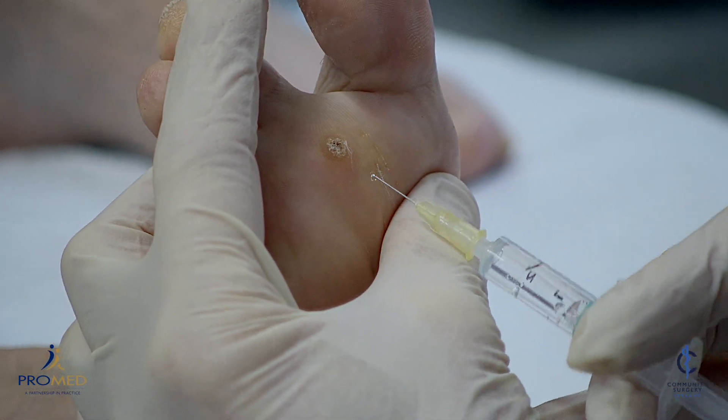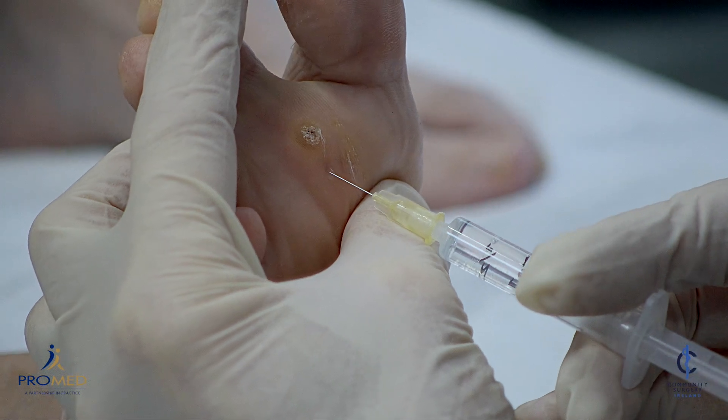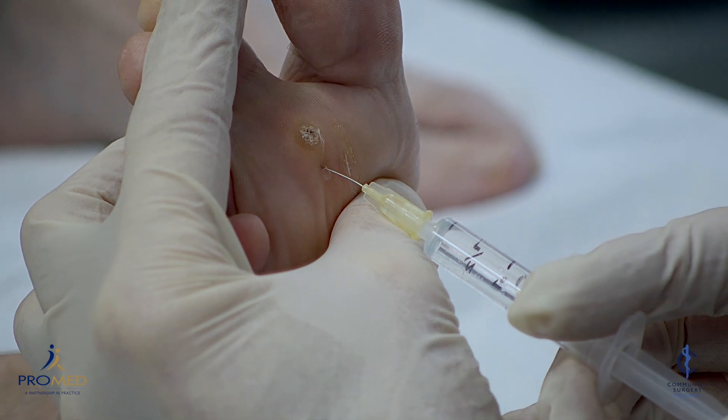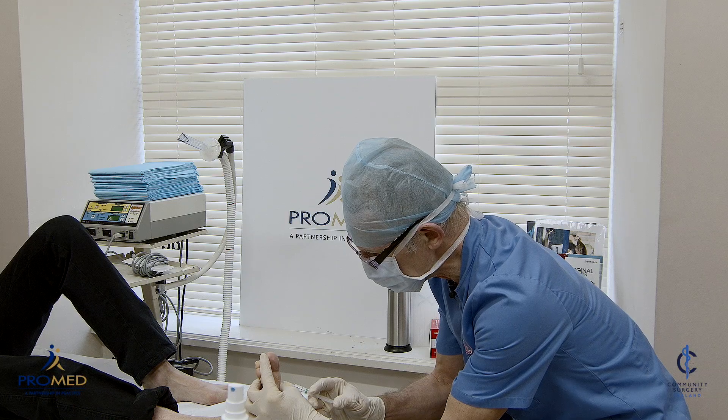Small pinch, Pauline. Just bear with me. Small pinch. Try and bear with me. That's it. Nice and slowly. Try not to jump. This is the hard bit — makes the rest very easy. A bit stingy.